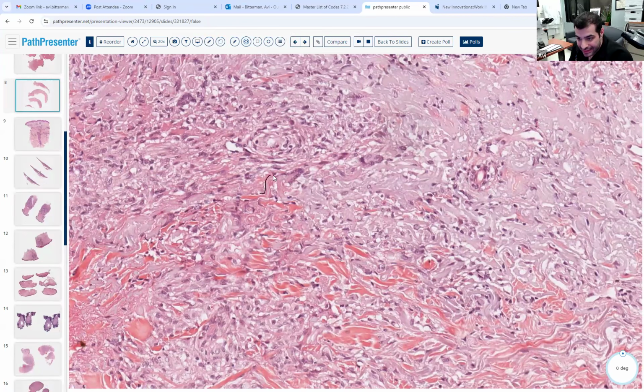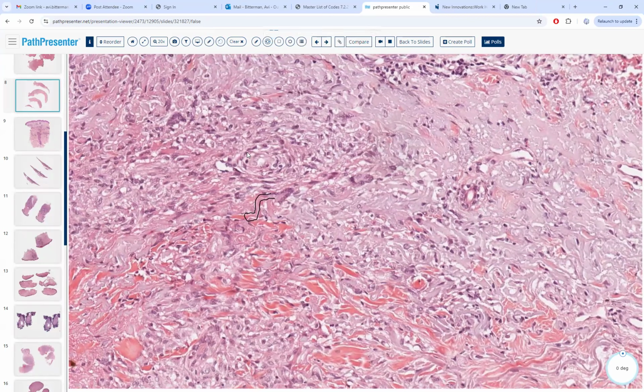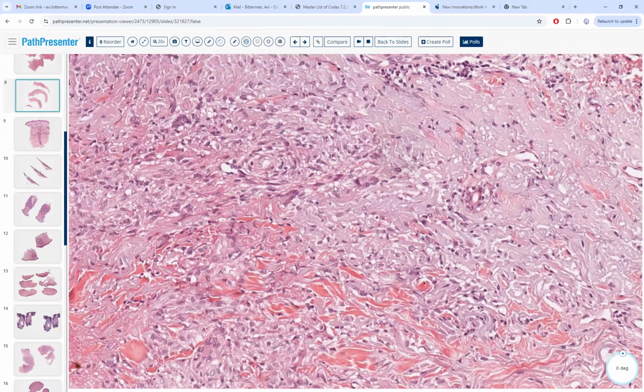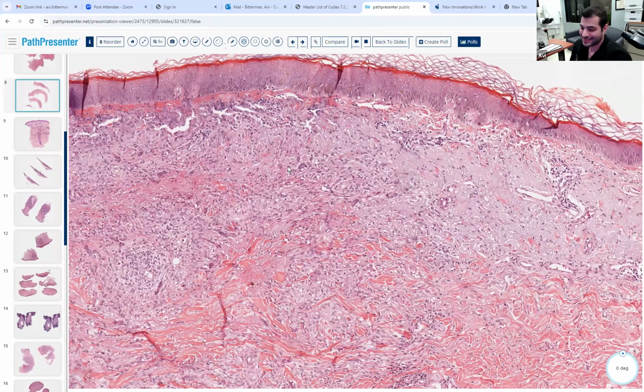And what's this? Is that like an elastic fiber going into the histiocyte? No, it's eating it. What do we call that? Elastolysis. Elastophago... Oh, elastophago. Like lysosome? Like the entirety of it? Elastophagocytosis. Yeah. Elastophagocytosis. All right.